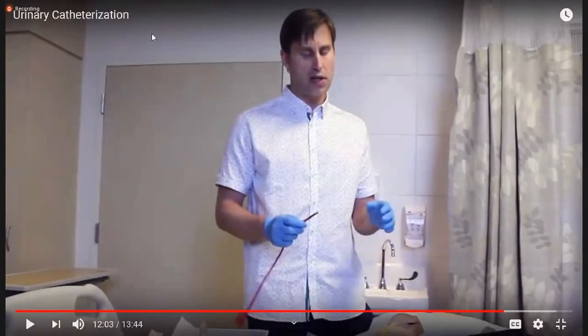Okay, two-way balloon catheter inflated size is a 10 cc syringe. We can use the 10 cc syringe of sterile water, and the three-way catheter balloon size is a 30 cc syringe. 30 cc sterile water. Through the 30 cc sterile water, inflate the balloon.